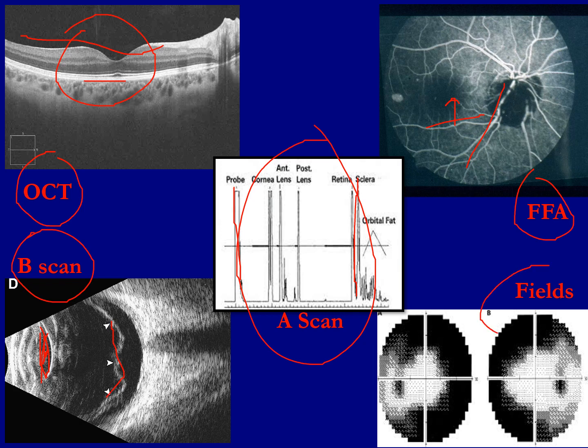And this is the visual field that you use in glaucoma, and it tells you how much you can see in the center and in the periphery. So this patient cannot see in the periphery, so it has visual field defects. So after having this background knowledge, let's start the MCQs.